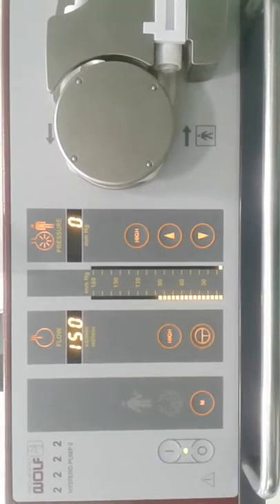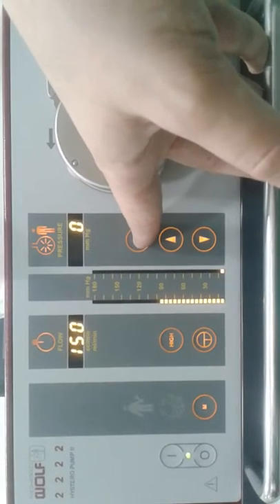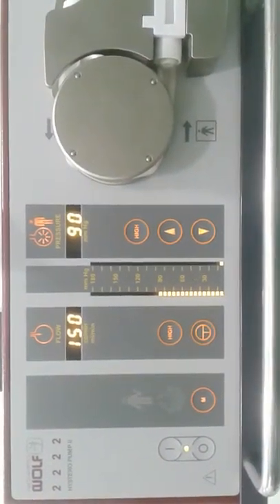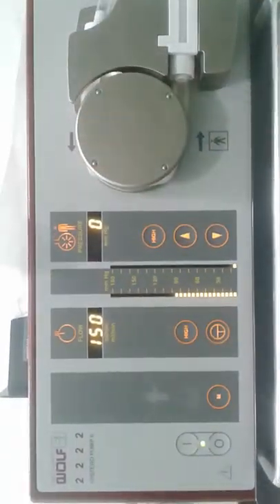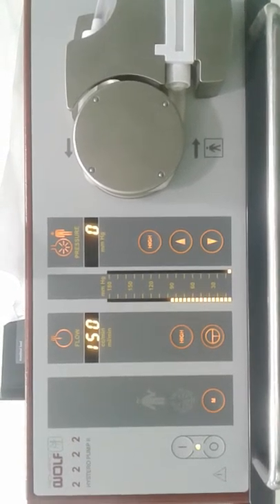This is if I need the high mode pressure, the highest pressure. I press this. The maximum is 180 for this nominal pressure, right? Yeah. We recommend using it from 50 to 180. Okay, sir. Pause. Make pause.